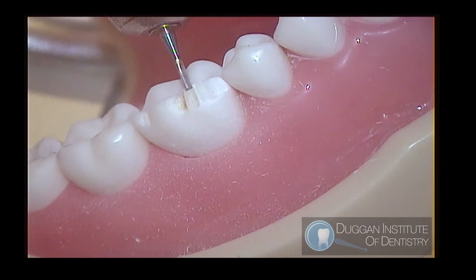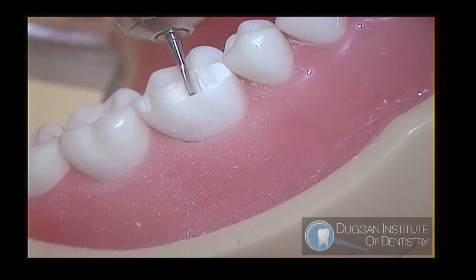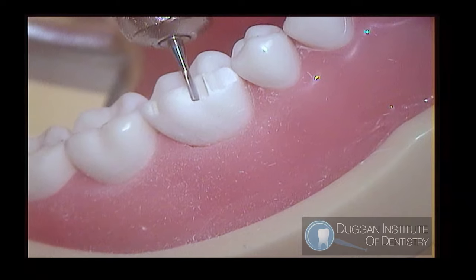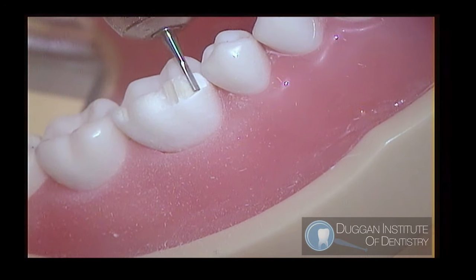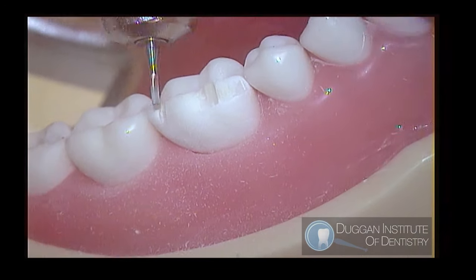Use minimal pressure to reduce and gently round cusps from the grooves to the embrasures. We may also take the angle from the matching adjacent cusp, which is a 45-degree angle.